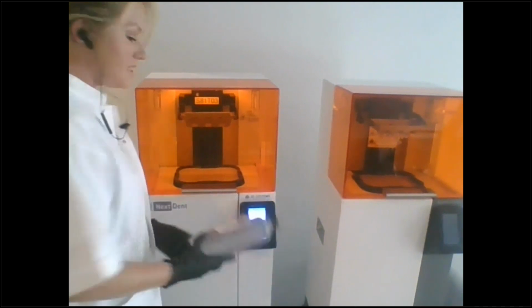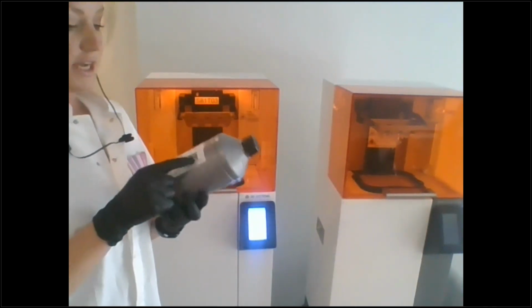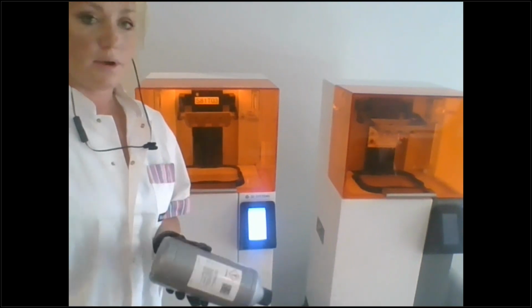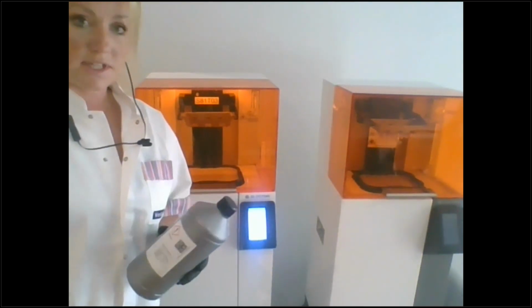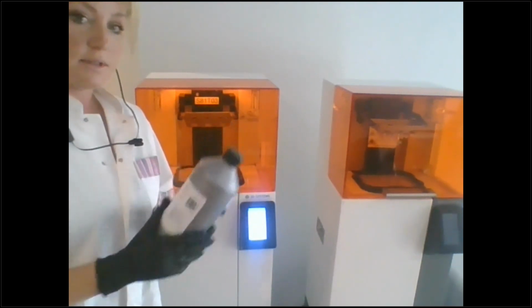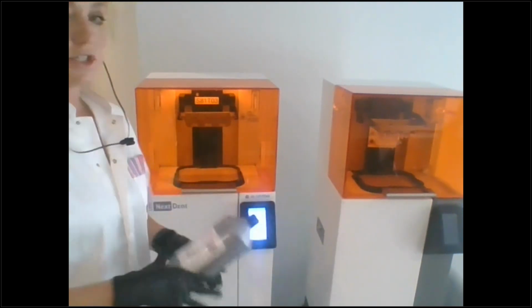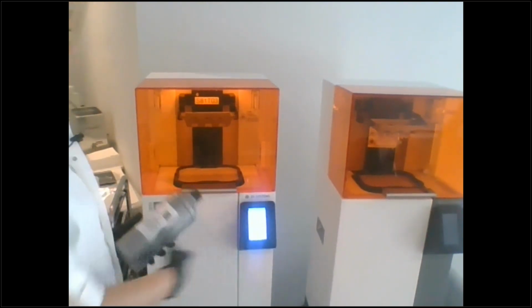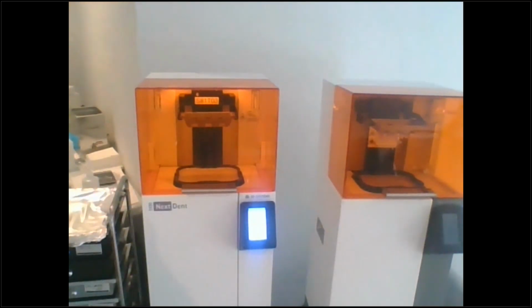So if you just take it off your roller, you can also print out this barcode if your mixers are across the room. Maybe you have a big lab and you mix in a different section than you print. You can just print out all of your barcodes, take a little picture of them, and then just hang them on the side, like maybe a magnetic hook, and then you can just grab it and use it.